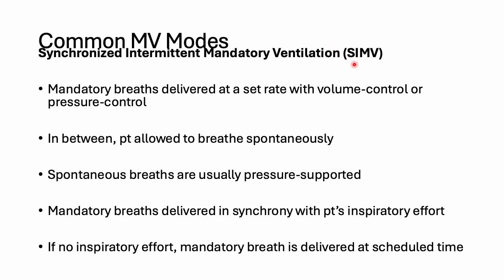If a person is on SIMV and receiving volume controlled SIMV, you may see on paper the respiratory therapists or the nursing colleagues or the medical colleagues document this as VC SIMV or SIMV VC for volume control, and pressure control as PC SIMV or SIMV PC. So it tells you that the patient is on SIMV and the machine breaths are volume controlled or pressure controlled. It cannot be both, it's either or.